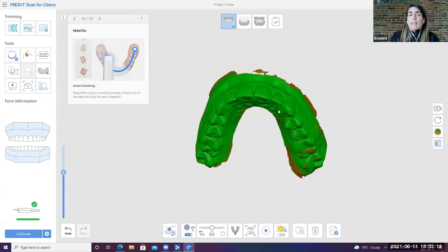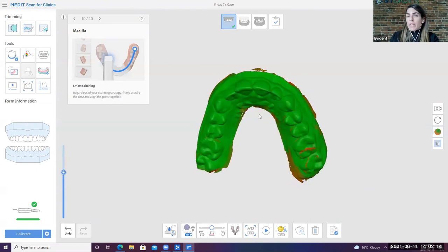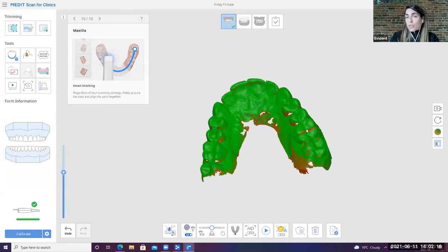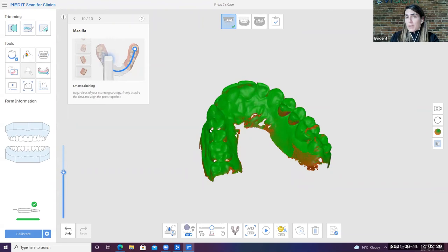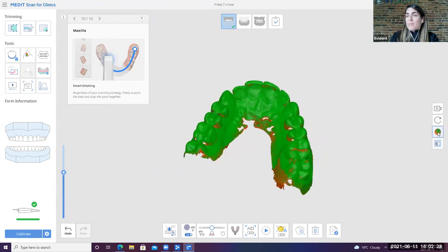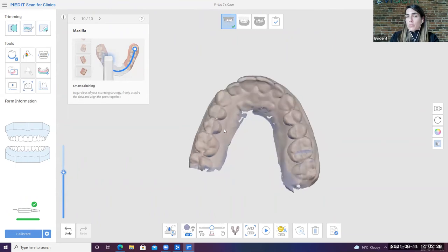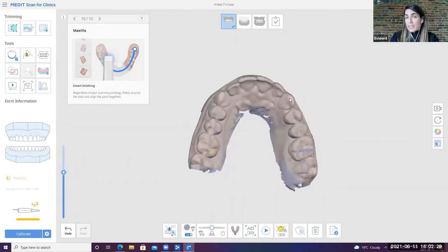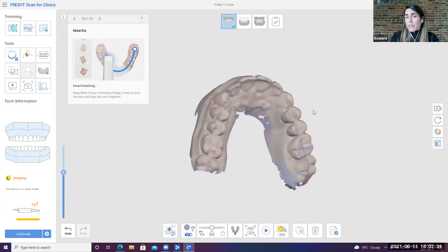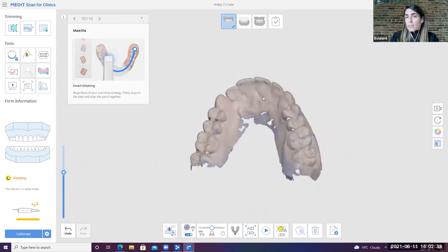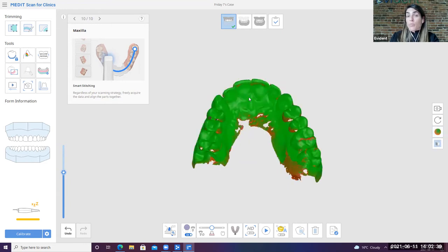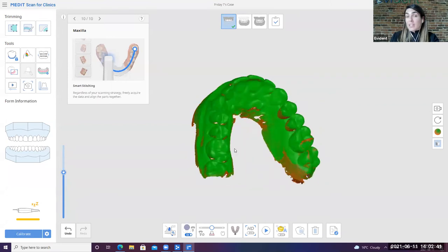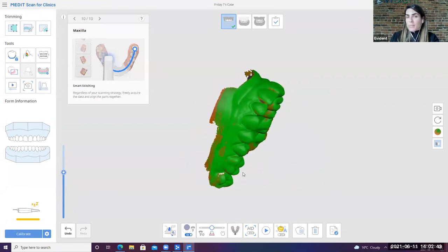So I scan it in a readability map so that I can see that anything that is green is good. Anything that's red, you can see that with data. And I can clearly see these pieces of teeth structure that is actually missing. Sometimes with the natural tooth view, so if this was an actual patient, you would see gum and then you would see teeth. If you're rotating this really quickly, due to the contrast in the background, sometimes it can be a little bit tricky to see those missing pieces. So I oftentimes like to just double check in this view right here, because I can clearly see where I've got to go in and capture the scans.